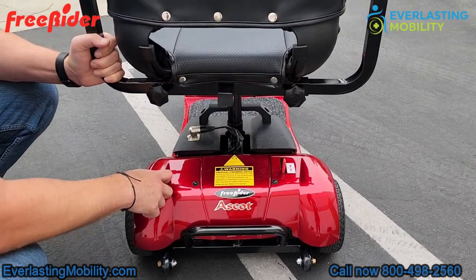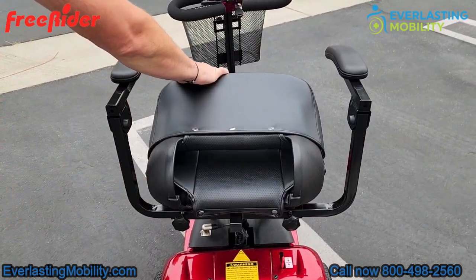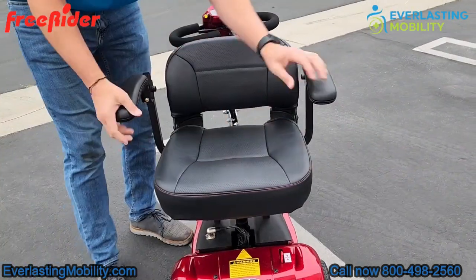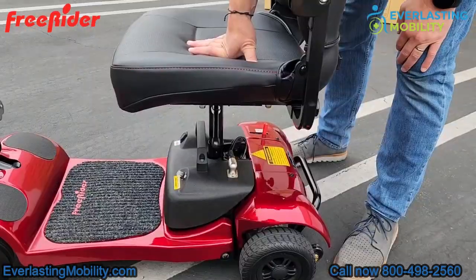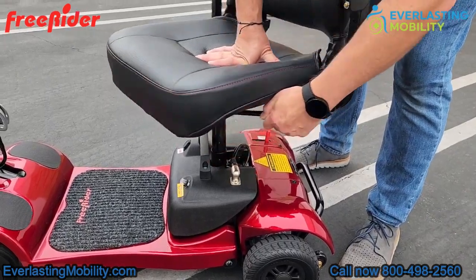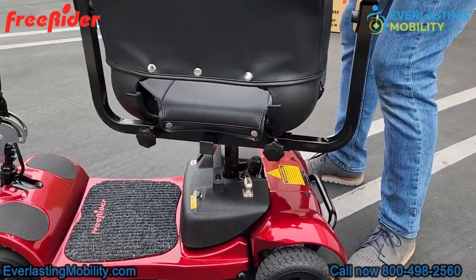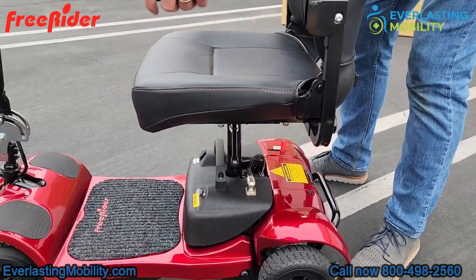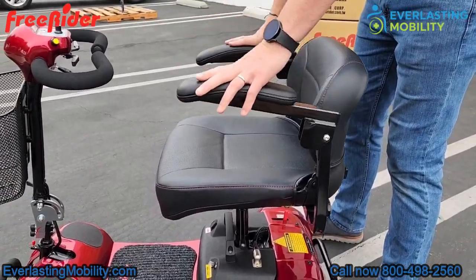The seat is a deluxe stadium-style seat with a lot of padding — one of the more comfortable seats on the market for a portable mobility scooter. The armrests also have padding and flip up for easy entering or exiting. You can also pull the lever on the side of the seat to swivel it 360 degrees, which is great for getting in with assistance or pulling up to a table.